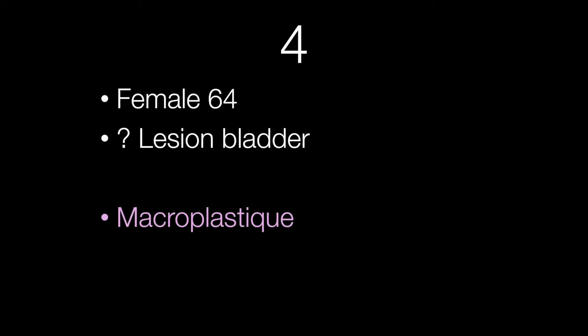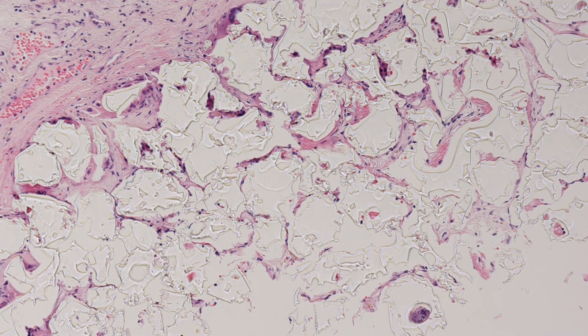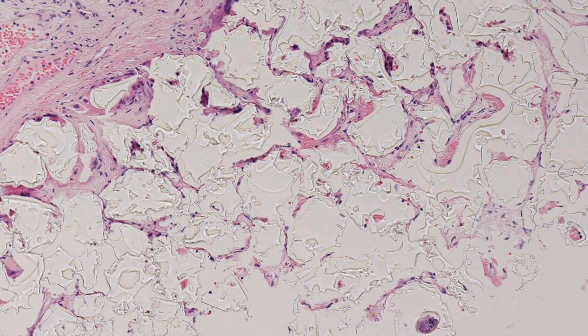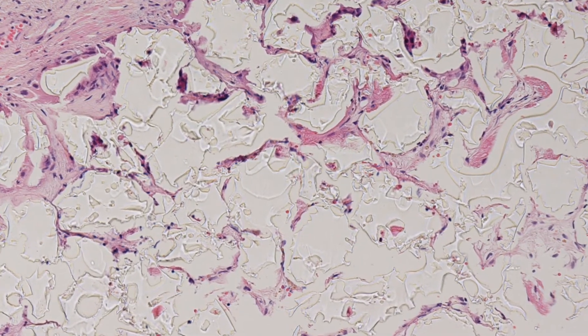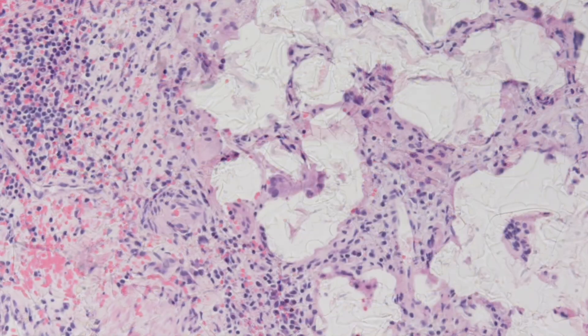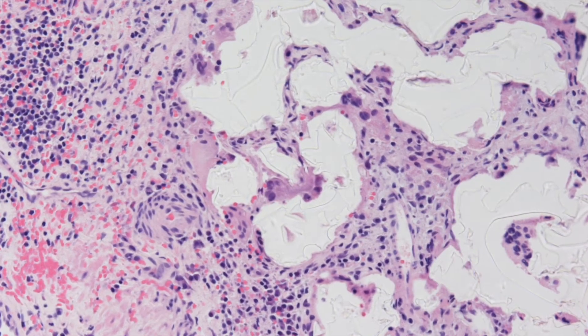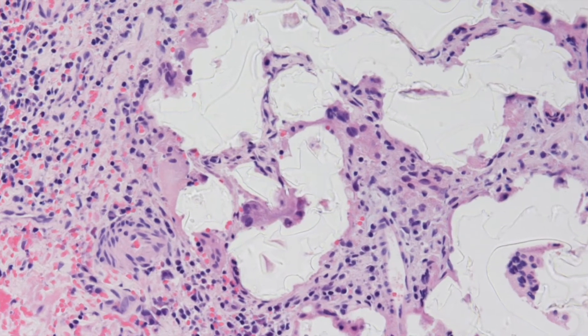This is a good example of macroplastique presenting as a bladder lesion. It has a characteristic histological appearance with these clear fragments surrounded by foreign body giant cells and lying in a rather fibrous stroma that they have caused.